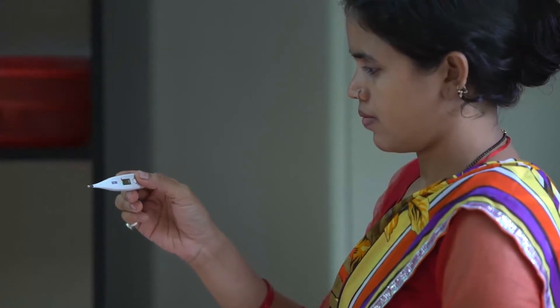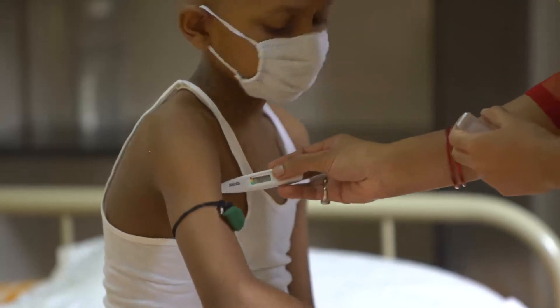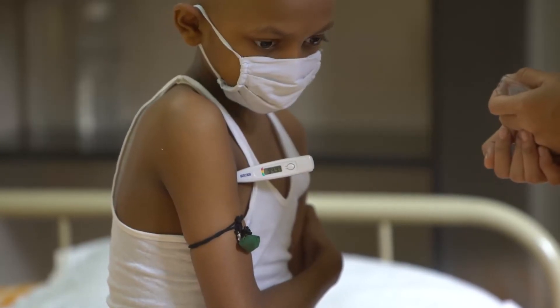Turn on the thermometer by pressing the button. The screen will show the reading LO. Place the bulb of the thermometer into the armpit and make sure that the child holds it firmly in place without moving it.